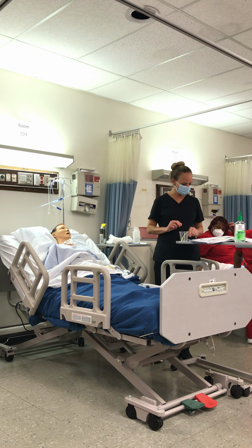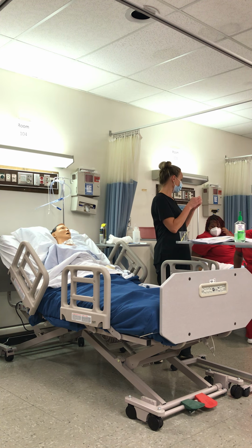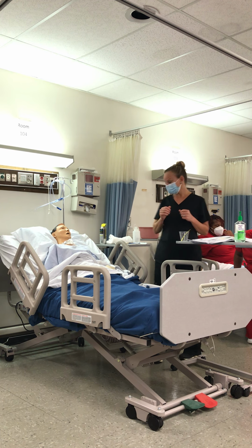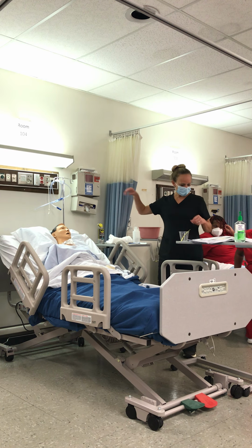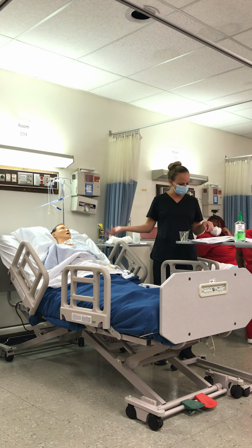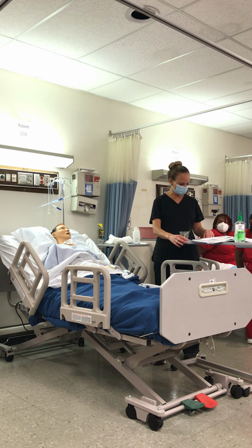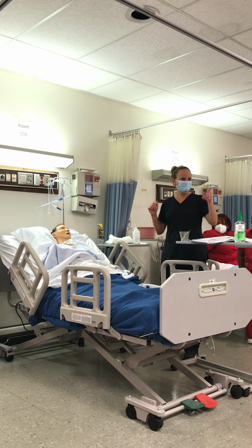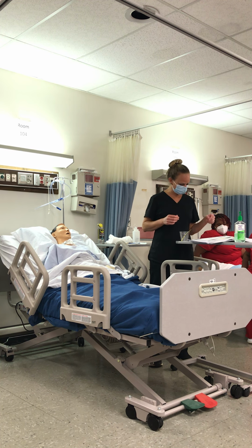Water, straw, a lubricant. I couldn't find any little packets of lubricant, okay? I don't think you guys have them in your pack either, but you would want to have a lubricant, which is this here. And tissues, which we've already used. Tape to tape what? The tube. Our emesis basin, I did have one and it's gone now. Y'all can pass me one. I lost it sometime yesterday.